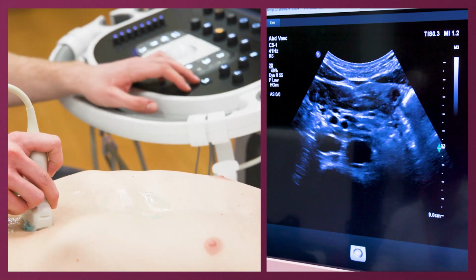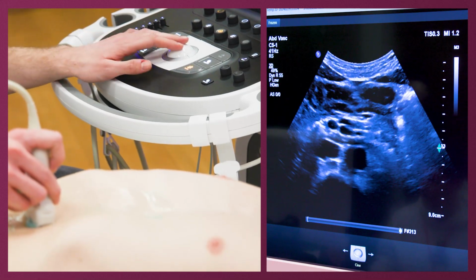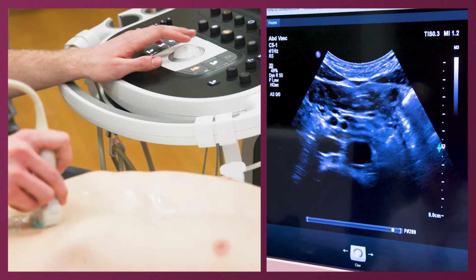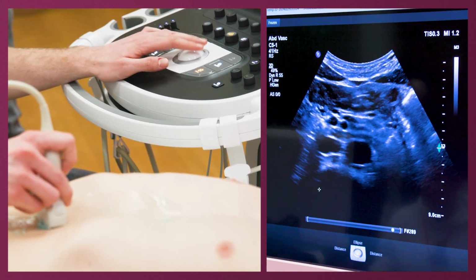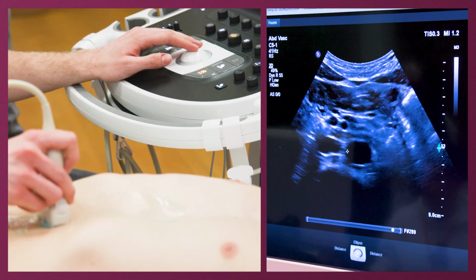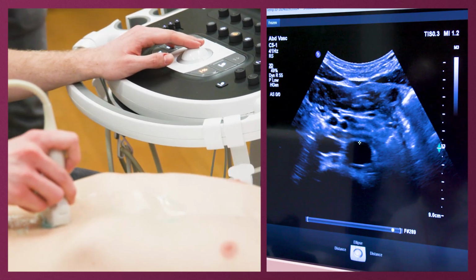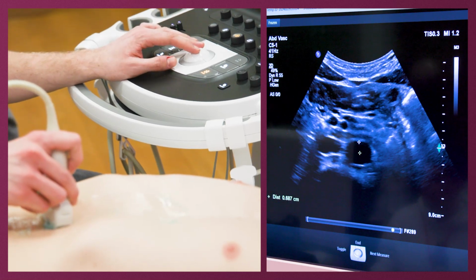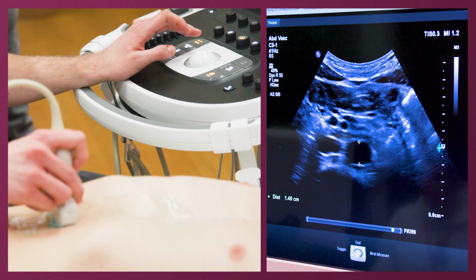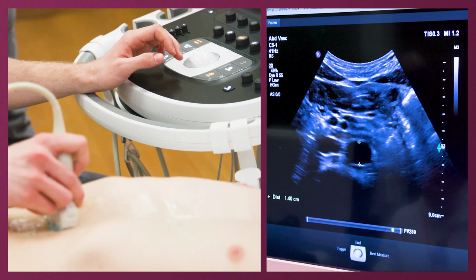If I freeze, now you try to use the trackball, and you need to take the systole. Yes, that could be this one. And you do the measurement. You have to take it at this border, AP. It's because on ultrasound the lateral borders are very poor. The ultrasound beam goes parallel to this, so there's no good echo. So I have 1.4.